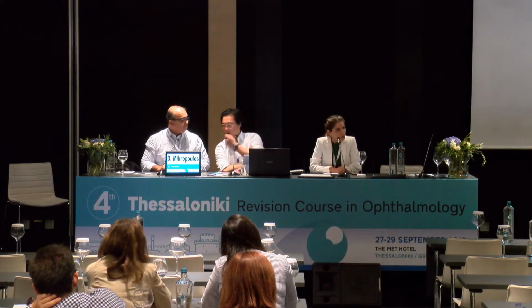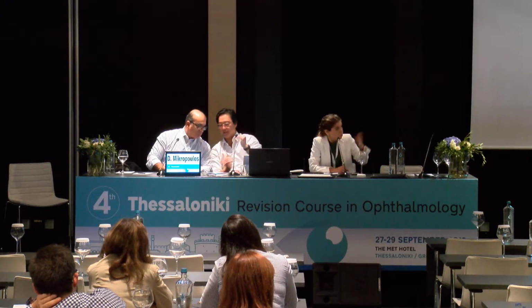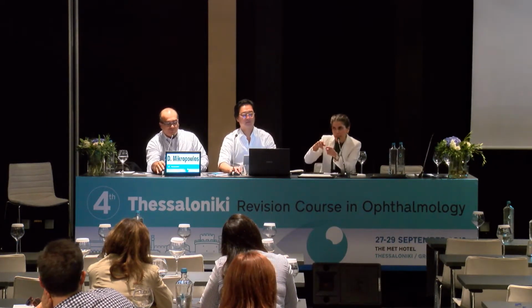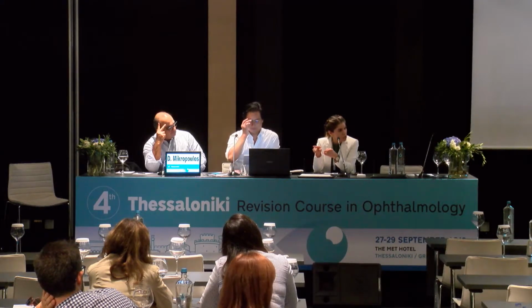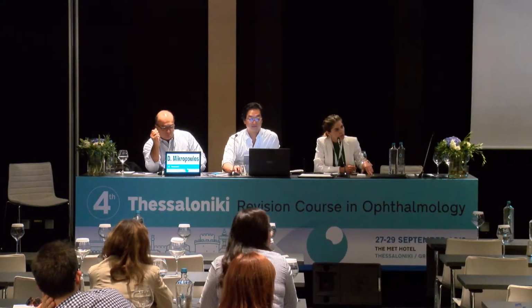But I would argue that if you decide to change the settings, which we do sometimes, everything that we know about the progression algorithms don't apply anymore, which means that, yes, you can change the stimulus so the patient can see it, but what you'll be seeing in the follow-up exams, you'll have absolutely no idea if it's variability or if it's change. I'm not saying you shouldn't do it, I'm just saying that it will be very tricky to monitor these patients this way.